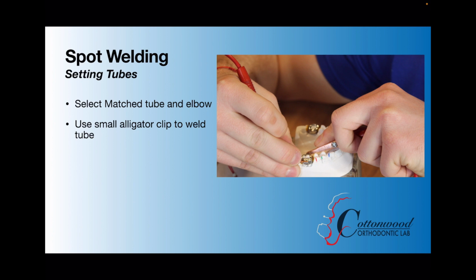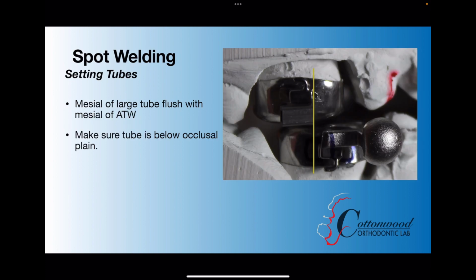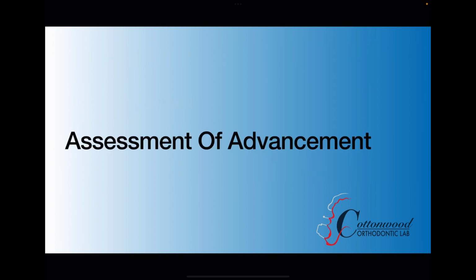You also want to make sure that you're placing the mesial of that tube flush with the mesial of the lower archwire tube. Here's a close-up picture to see that. Once again, the large tube is flush with the mesial of the lower archwire tube. And once again, you want to make sure that the large tube is not above the occlusion. If they start biting on that, they're going to rock that crown or band loose and or break the appliance.